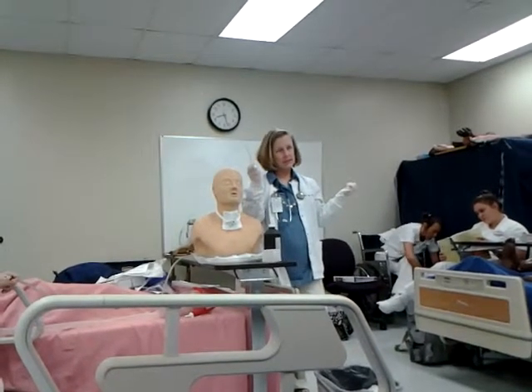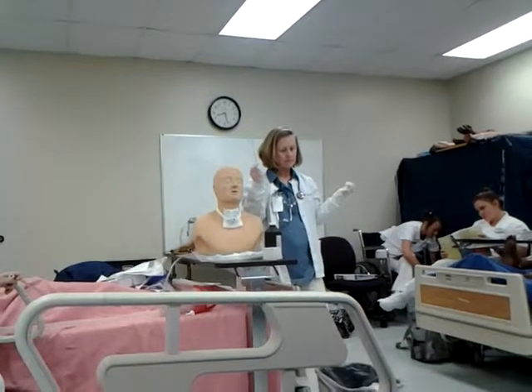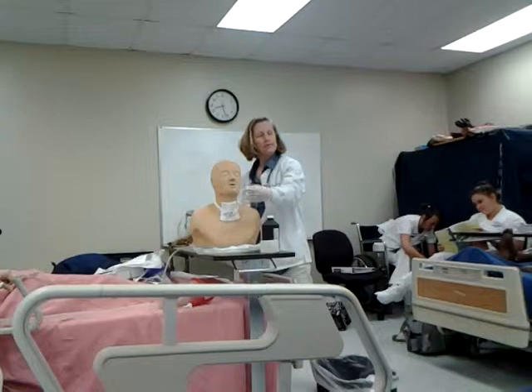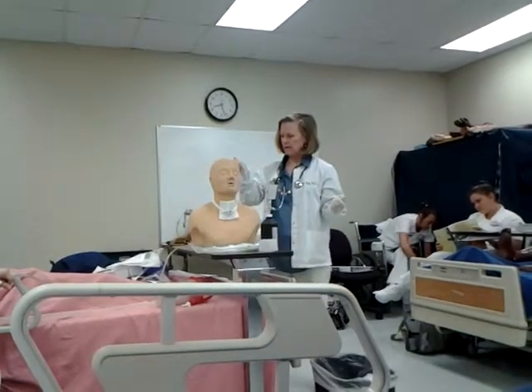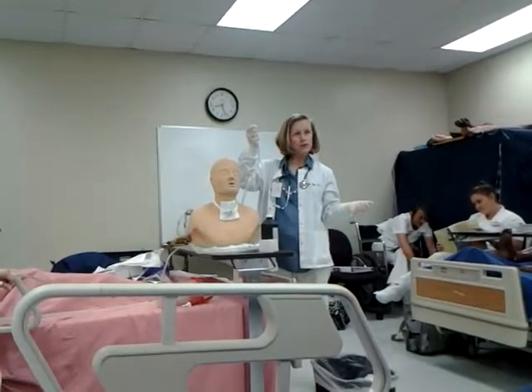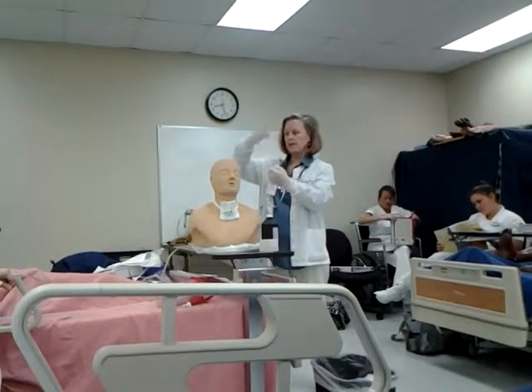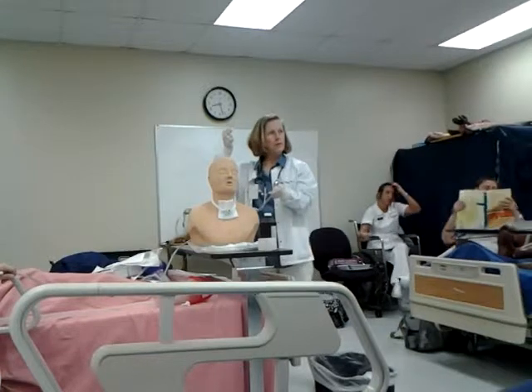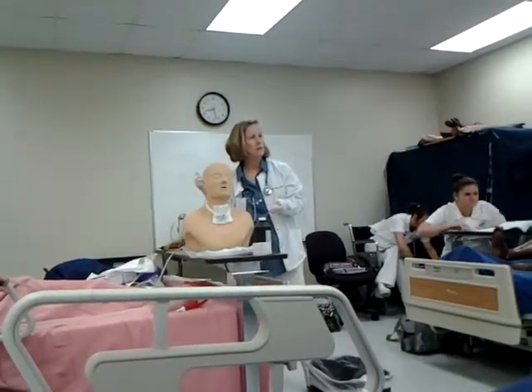Okay? I've kept this hand sterile the whole time. When I'm finished, I'm going to end by ventilating my patient. Is my sterile procedure over? I think so. Then I can roll this up. Take this. Yes, sir. No, we're going over this sterile procedure.